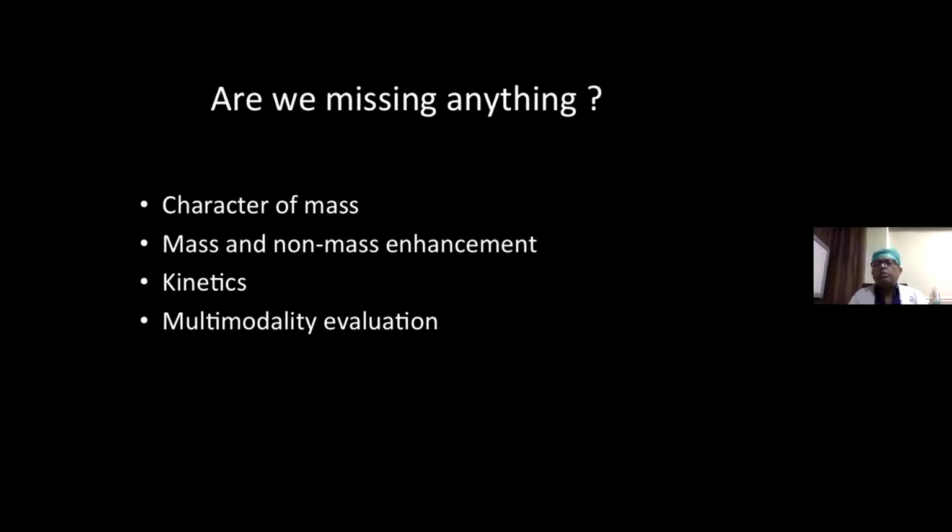So the question comes, are we missing anything? Apart from the fact that we look at the three factors that we need, we have to add in a multimodality evaluation, because at times MRI may create a situation where you have a false positive. So you need to put it into other modes of radiology and compare and finally come out with a conclusion. The new kid in the block is elastography. I am sure when I was a student like you, and even a couple of years back, I did not have any idea about the new kid.